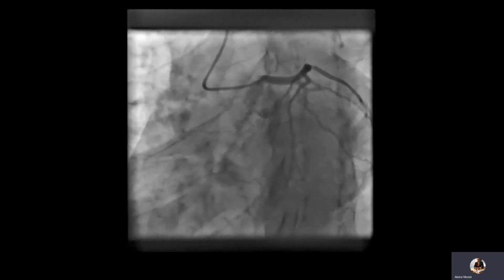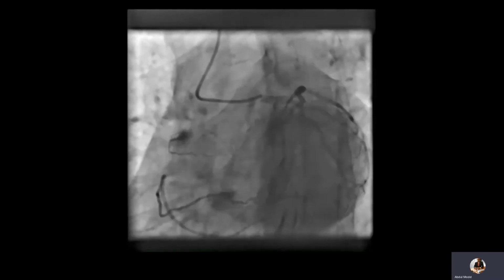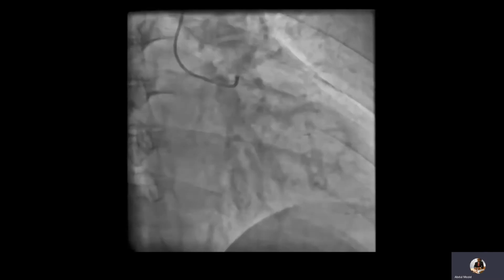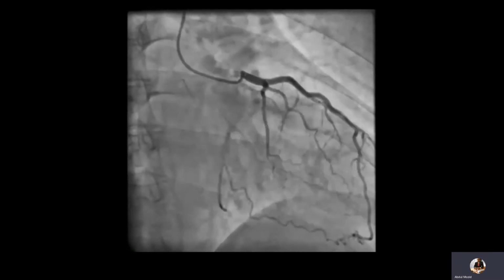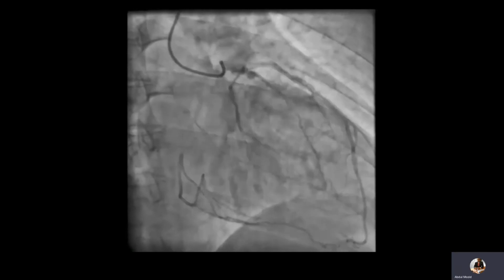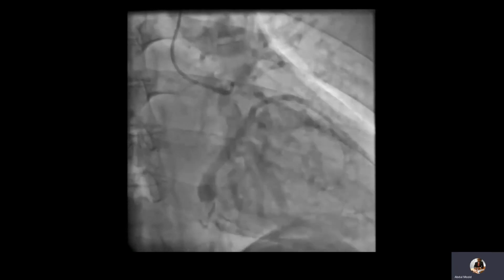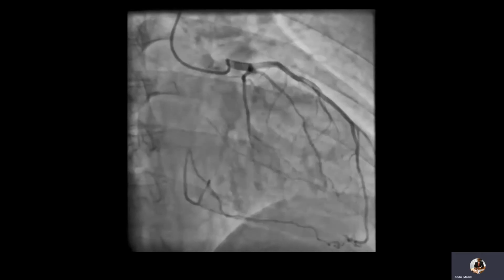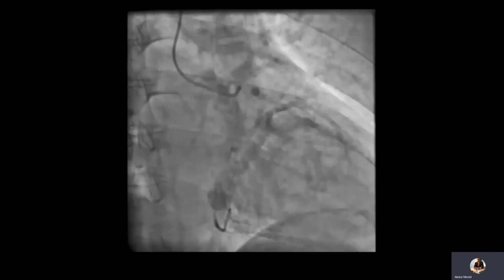This is his diagnostic angiogram from the previous procedure. This is the left coronary artery showing retrograde collaterals to the RCA. This is predominantly from an apical collateral from the LAD, which is very tortuous. There do not appear to be clear septal connections. There is a distal septal to an RV branch.